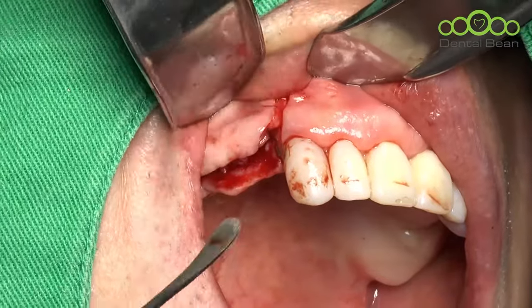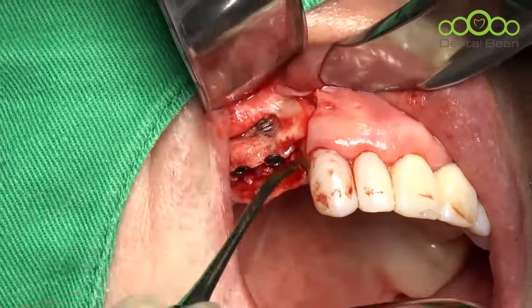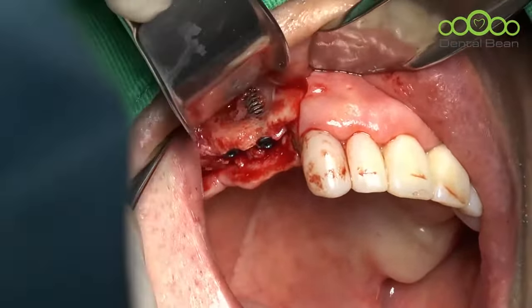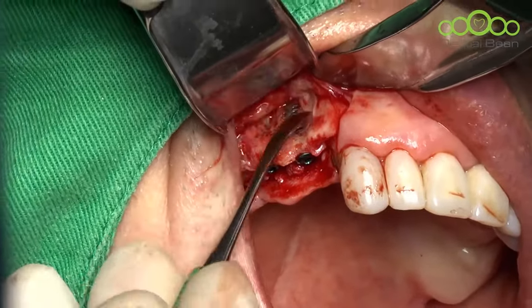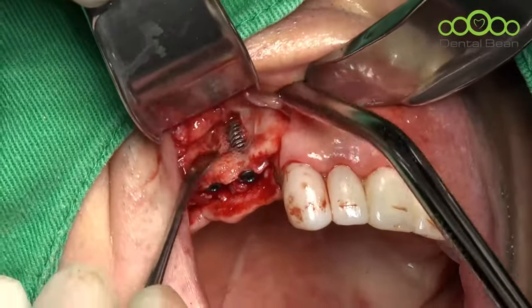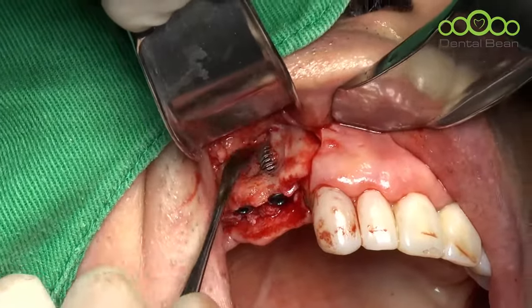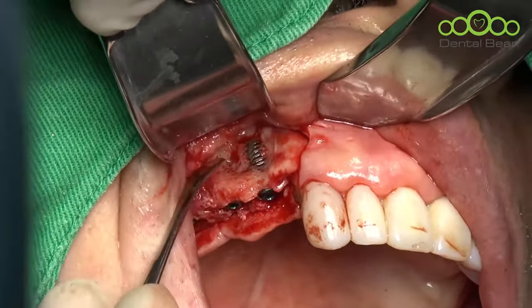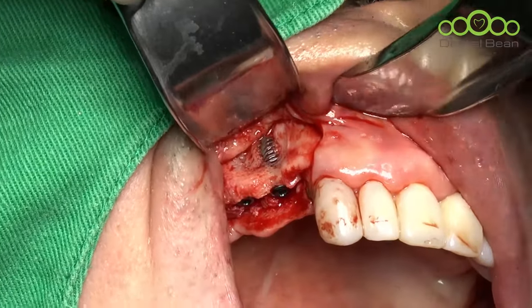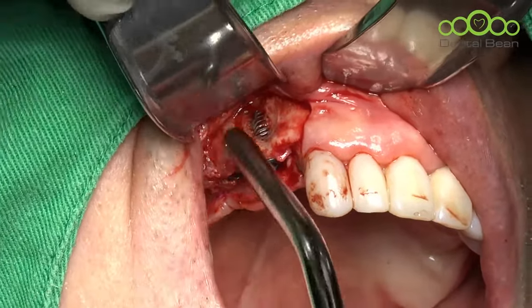Prepare the membrane. The graft. Here is the fenestration wound. After implant installation, it is better to do some bone graft in here. Show 0.5cc, the graft 0.5 gram. Okay, like this. Here is a fenestration. I have to do some graft here. This is not so serious, but I will graft.